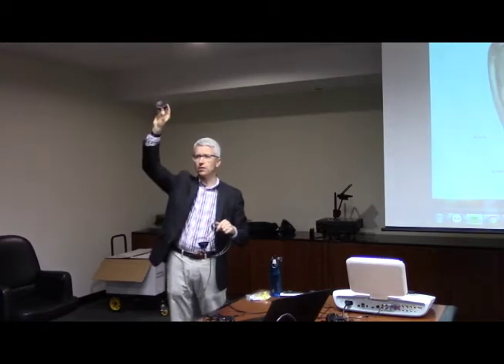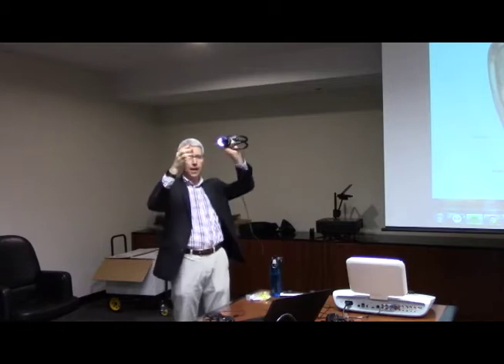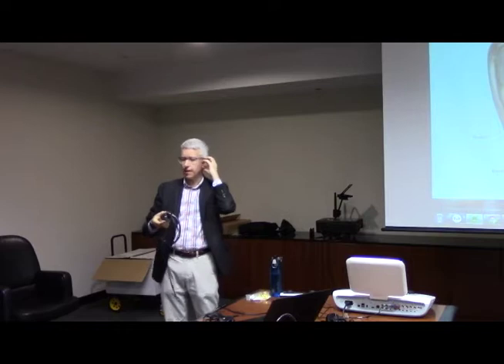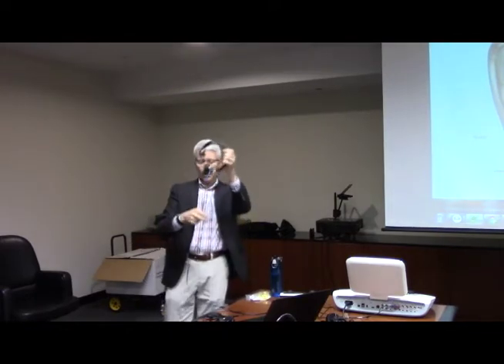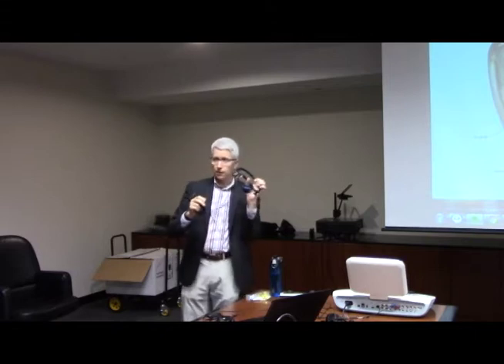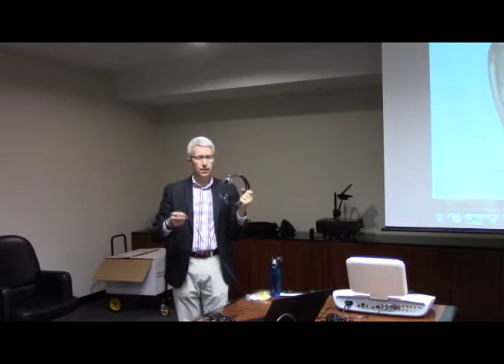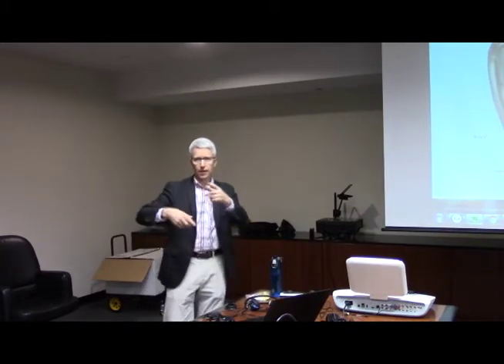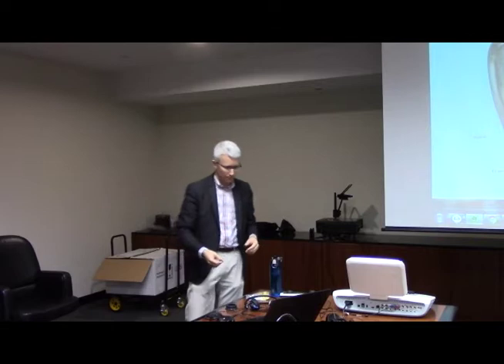These are the cushions. Sometimes they're red and blue, sometimes they're black, sometimes they're a little different shaped, but they are what go on the headphone and sit up against the ear. So you've got the cushions on there, you've got the headband, like I said, you've got the cord. A lot of this stuff is service parts, some of this stuff is consumables, and some of it's equipment. But we've got this whole life cycle of things: we sell the equipment, we service it, we sell the consumables, we do all of that stuff.